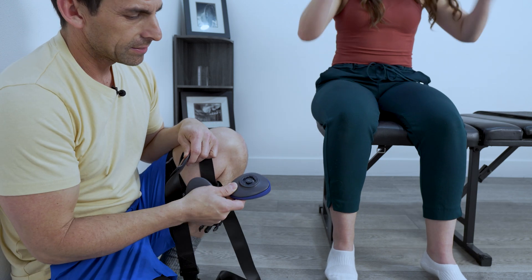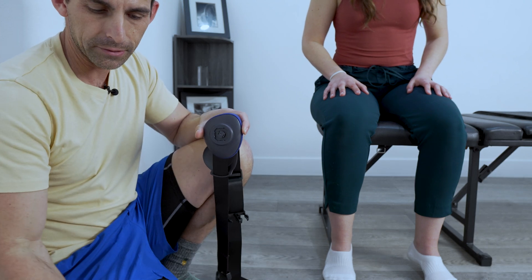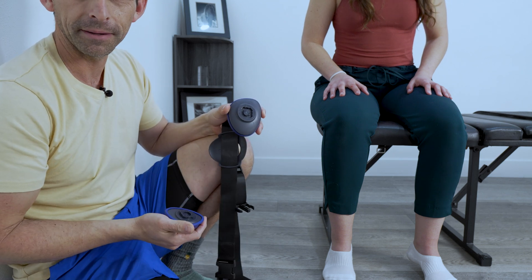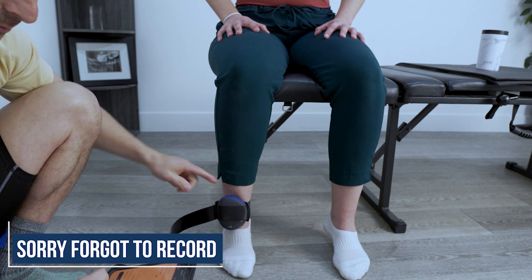Now we're going to change to knee extension. In order to do so, we have the other setting which is on a hard plate. Since it's going to be on Dawn's shin, she already said she doesn't want that hard thing on there. So I'm going to change this one out and set it all up again. Now she's all set up here.